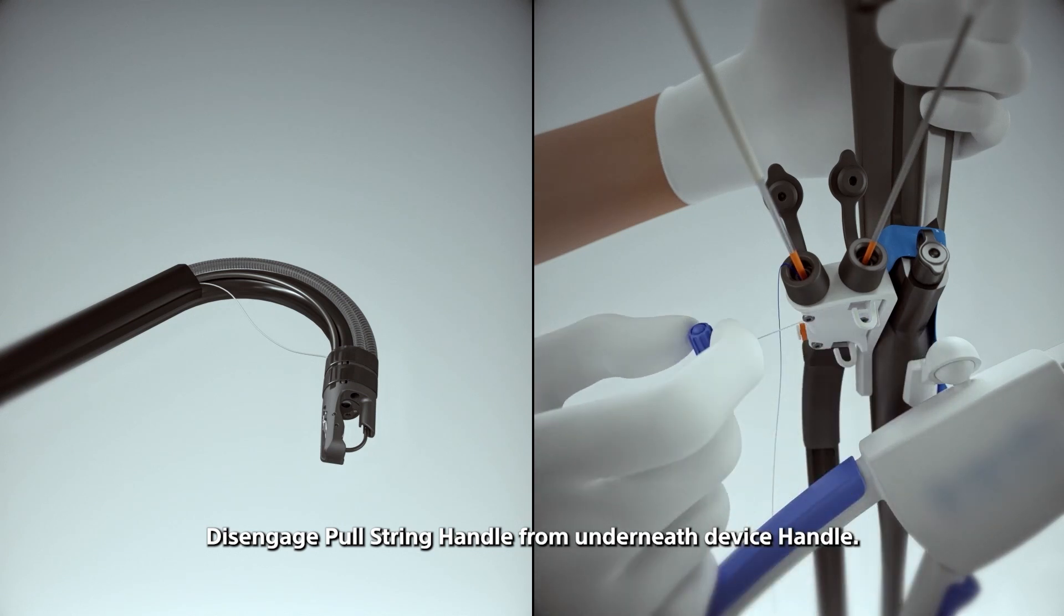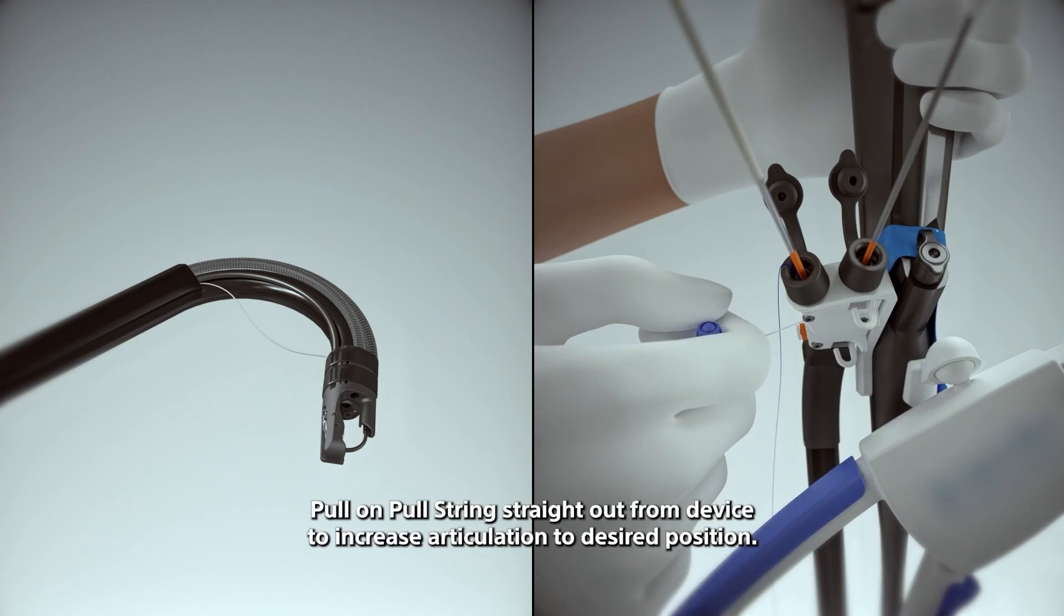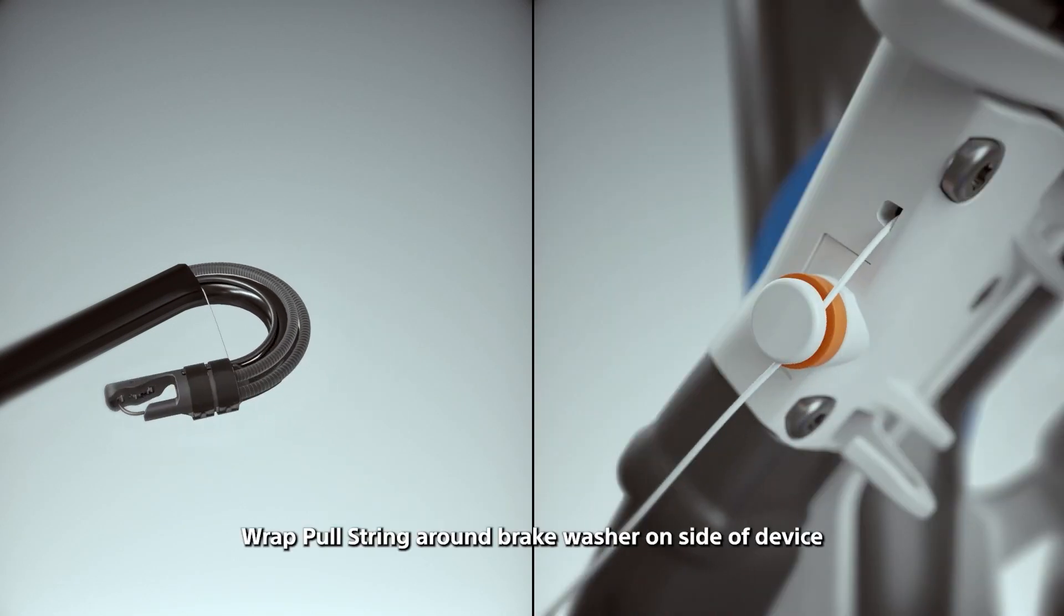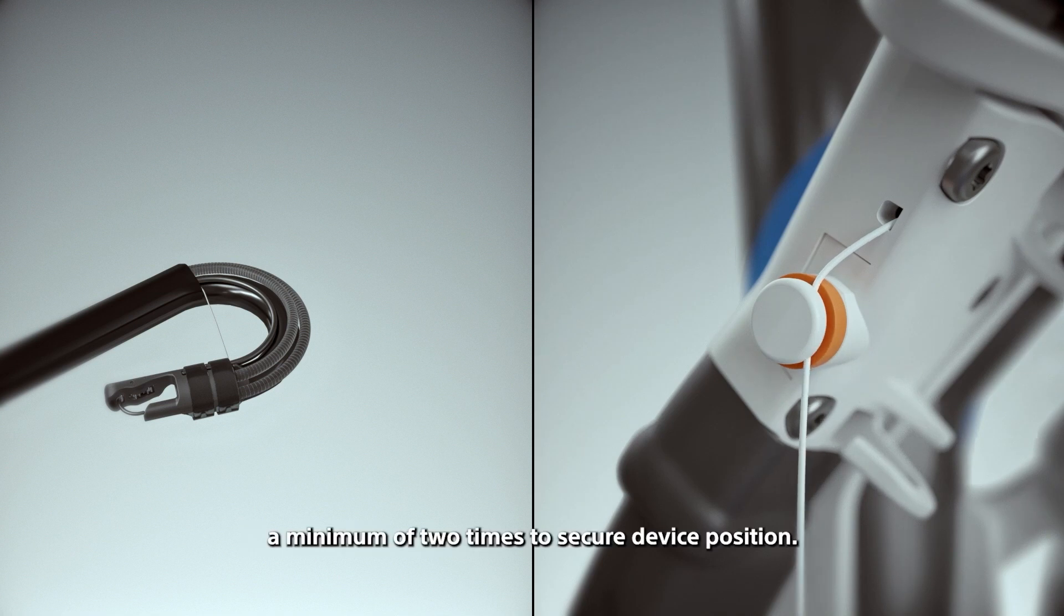Disengage pull string handle from underneath the vice handle. Pull on pull string straight out from device to increase articulation to desired position. Wrap pull string around brake washer on side of device a minimum of two times to secure device position.